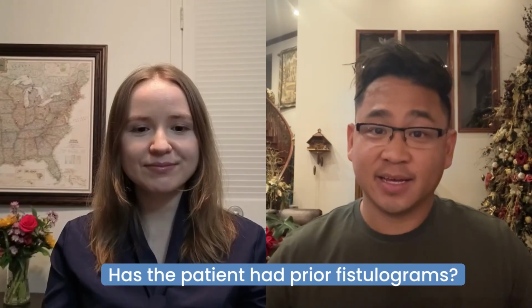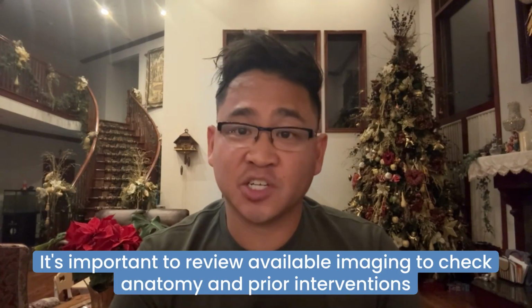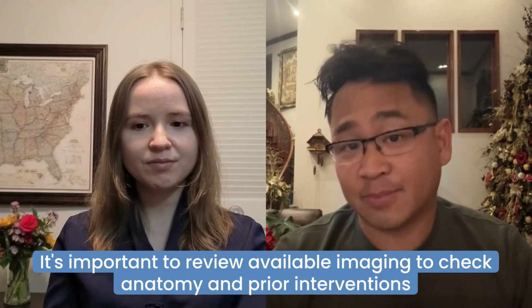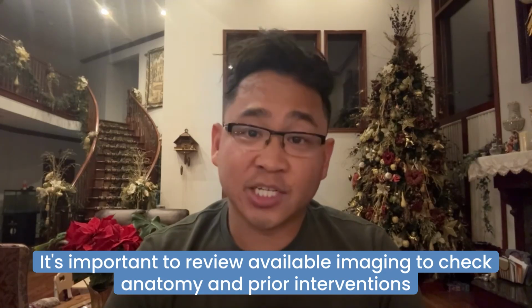The first thing I like to know is whether the patient has had fistulograms in the past. That's usually the best reference to plan the fistulogram for tomorrow because it'll usually tell you where the patient's problem areas are. Most of the time, you get all the information you need. While there's only three main types of vascular surgery AV fistula creations, as they age, they may require some sort of surgical revision. They may have an old fistula that's right next to another fistula and or partially involving it or connecting to it. Some bizarre, unexpected type of anatomy or surgical change that you wouldn't know unless you looked at the prior images. So I would start there.